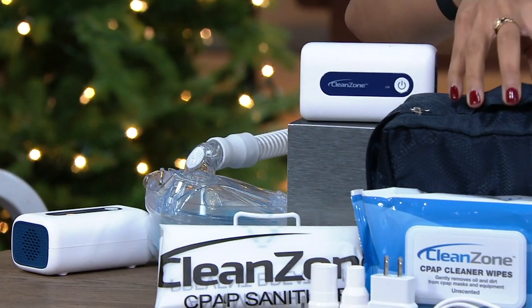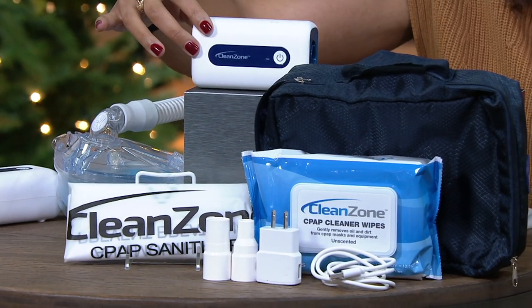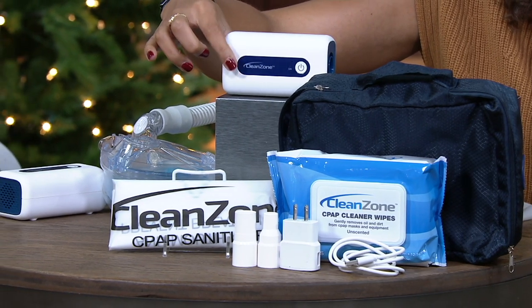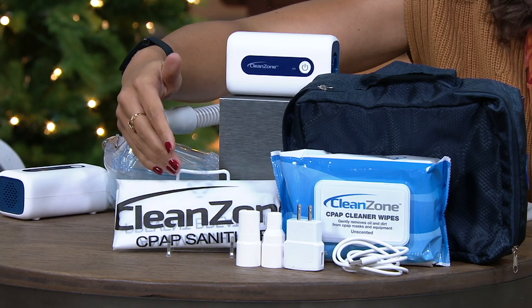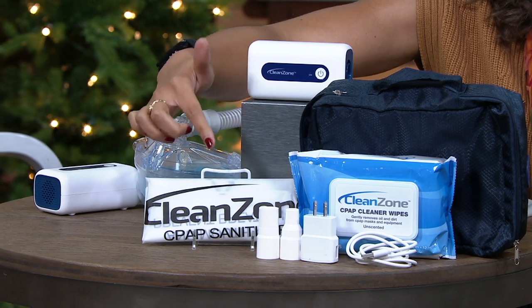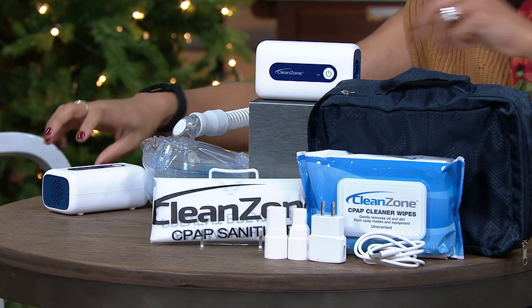You're getting the case, and you're also getting the Clean Zone CPAP accessory — that's how we're going to be charging and using our unit. They also included the clean sanitizing wipes; there are 62 of them in this kit. And down here below, you're getting the charging system with the cord as well.